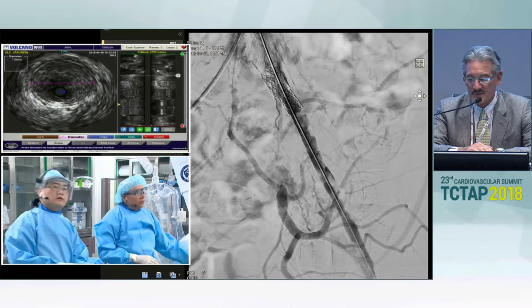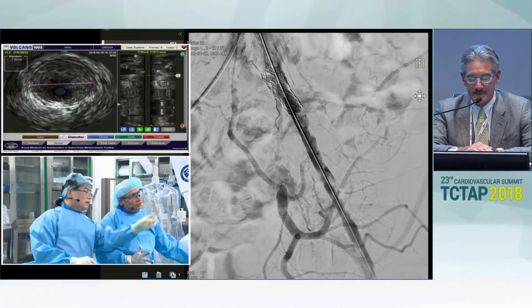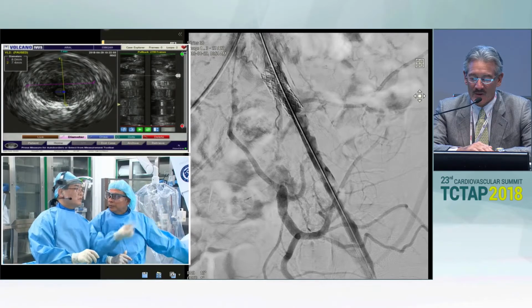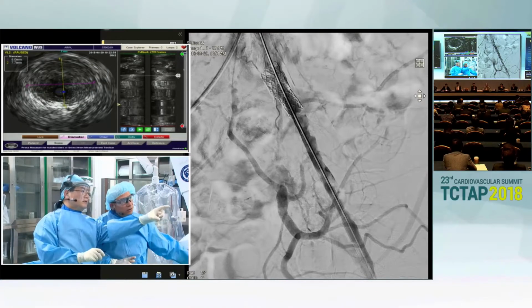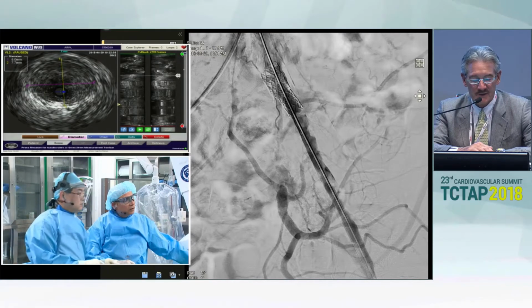Good, 8 millimeter self-expanding then. We're going to use a balloon expandable stent. You're getting pretty distal there. I would use self-expanding just distal to the stent graft. And you want to do a balloon expandable after that? Yeah, covered stent. We don't have a self-expanding in the external iliac. Yeah, you could use a covered stent for the ISR and then self-expanding for the external.